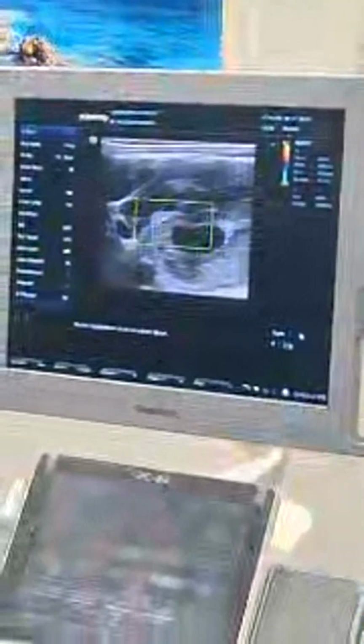You can see the needle which is going under guidance without damaging any structures, any blood vessels, including the carotids. Even though we are very close by, it's a micromillimeter precision. We are not damaging any nerves or any vessels, taking care of only this nodule. So that is the beauty of imaging. This is an image guided procedure, completely under image guidance.